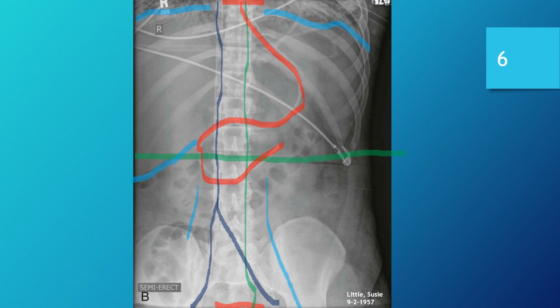However, there are a few things that we could have changed that would have helped in the appearance of this image. And the main ones, of course, my line got a little crazy there, but I think you see what I'm going for here. These EKG leads are moving across the upper portion of the belly, and it really does obscure anatomy, especially this one that goes all the way across the belly. It is not desirable for this image, and they should be removed if at all possible. So that is a definite must.